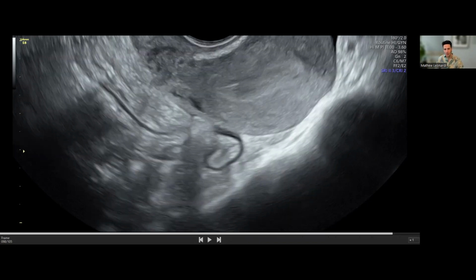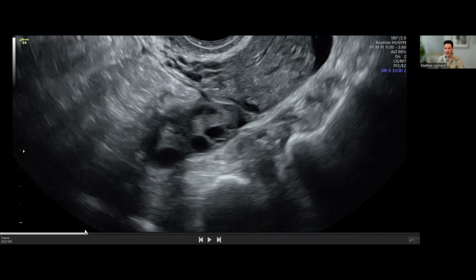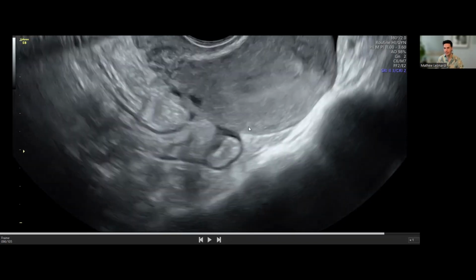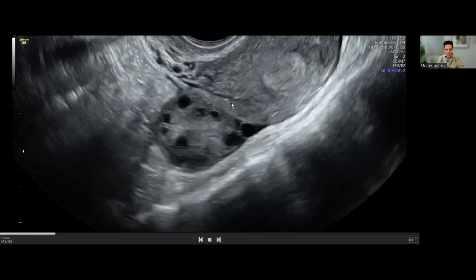We also have a lot more bowel in this clip here, but we've already assessed that. So cines are really useful because if after the fact you want to come back to something, you have a lot more information in that clip than you might think you've captured. I think I took another clip of it just for comprehensive sake.